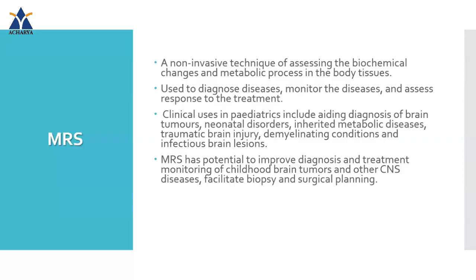For the detection of tumors, we have to undergo a procedure known as biopsy. But in the case of brain tumors, it is a very risky procedure. So in earlier cases, we used stereotactic biopsy for brain tumors, but after MR spectroscopy, it is a very helpful and easy method to identify and differentiate between benign and malignant tumors in brain tumors.